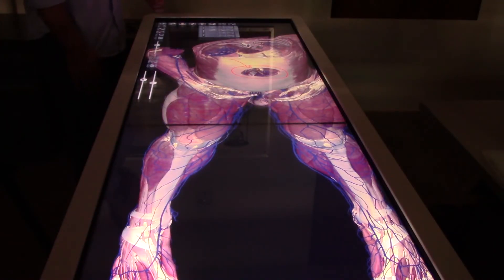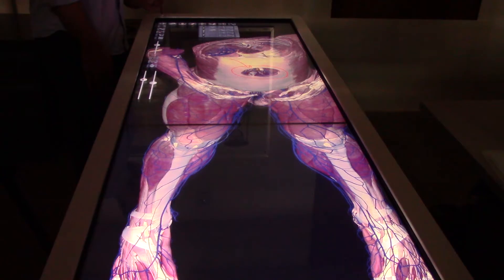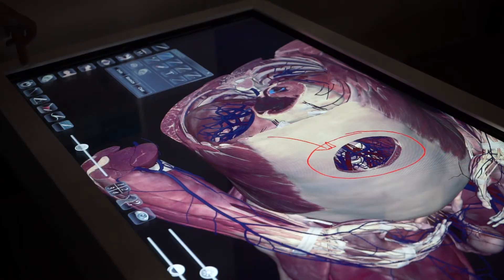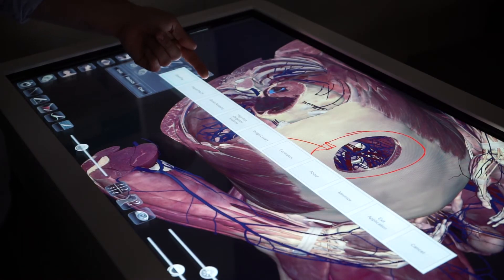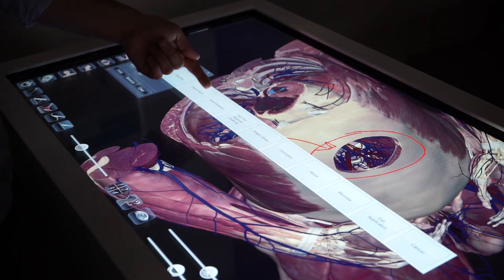So there you go — there's an overview of the basic tools offered for the gross anatomy models. By selecting the start button, you'll get a menu of other options to explore.